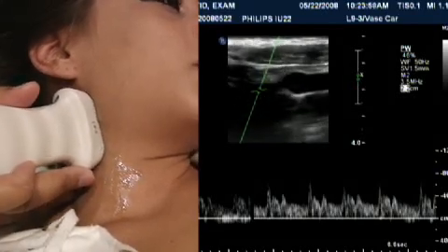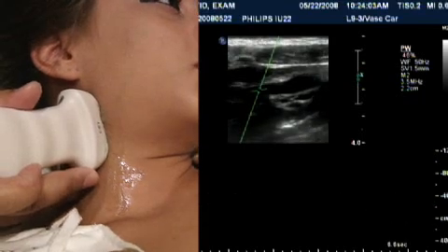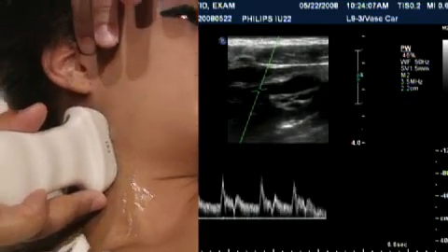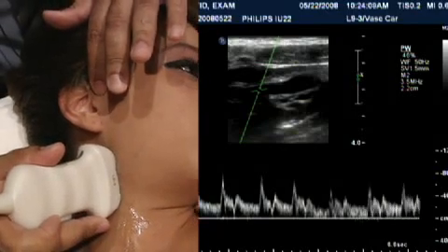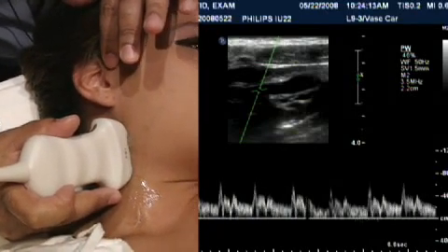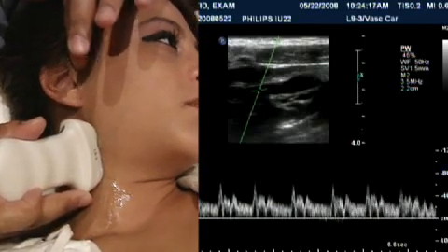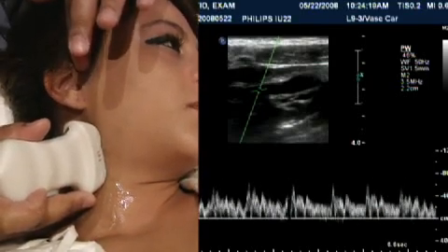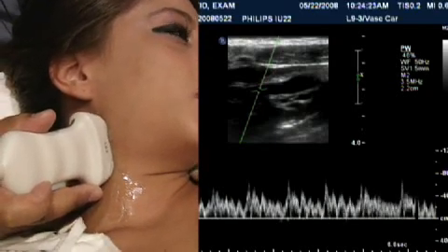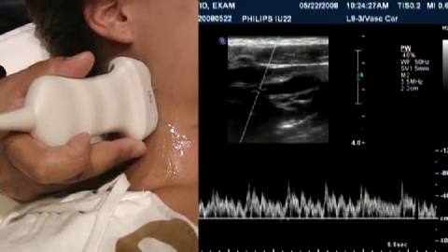Another thing that we can do is a temporal tap. So let's take a quick look. My guess right now is that this is external. So what I do is I locate the superficial temporal artery around the ear, and what I'm going to do is some light tapping and look for oscillation of the spectral waveform and see if there's any response. And you can see that as I tap the temporal artery, let's just freeze that image, we see some oscillation in the spectral waveform here.